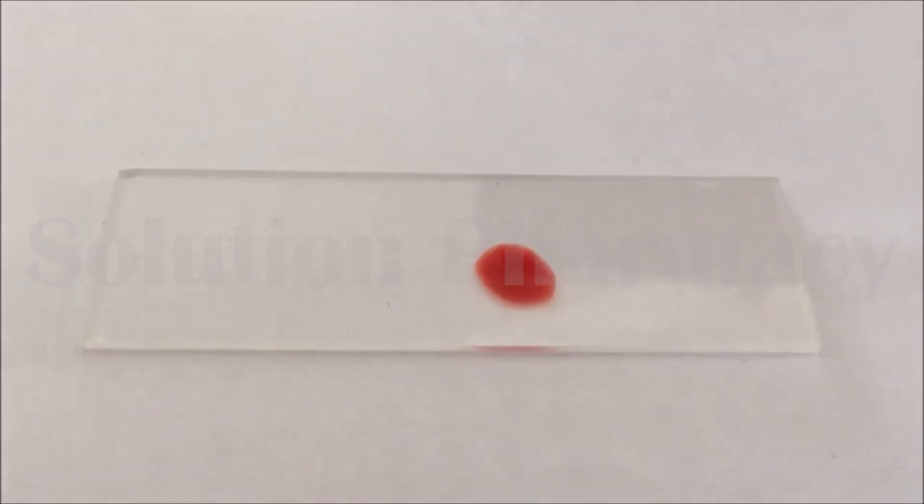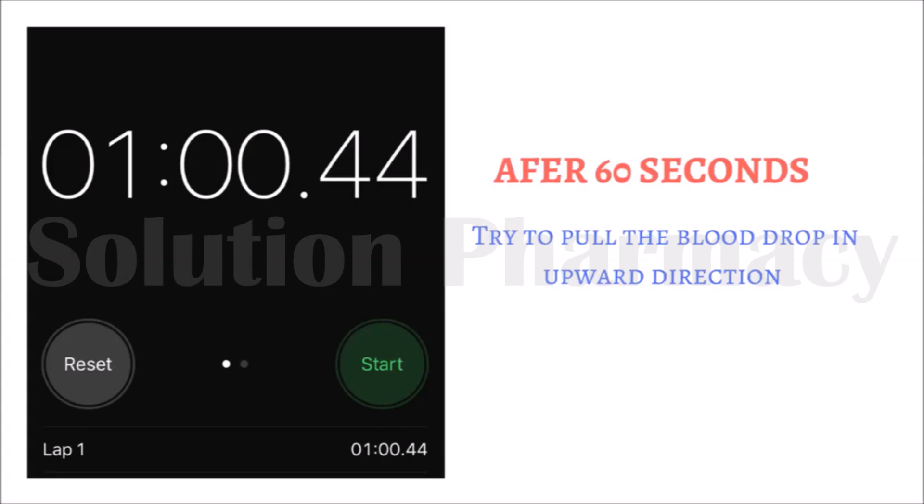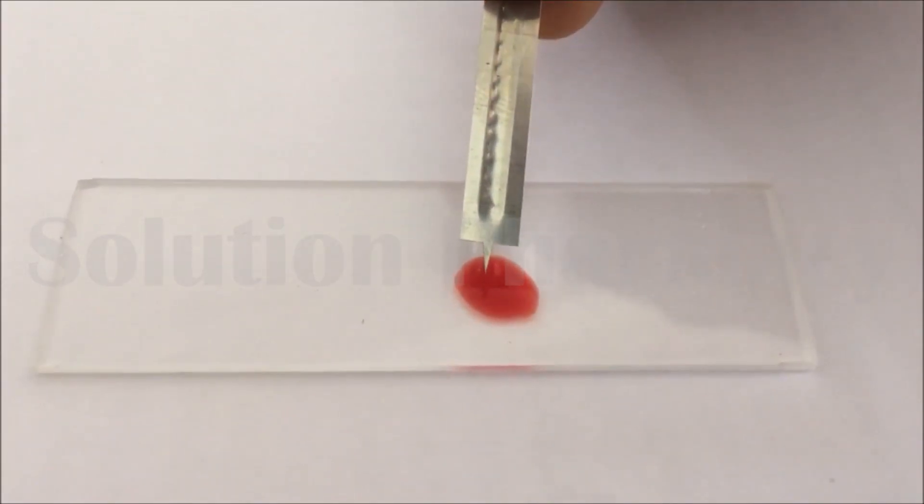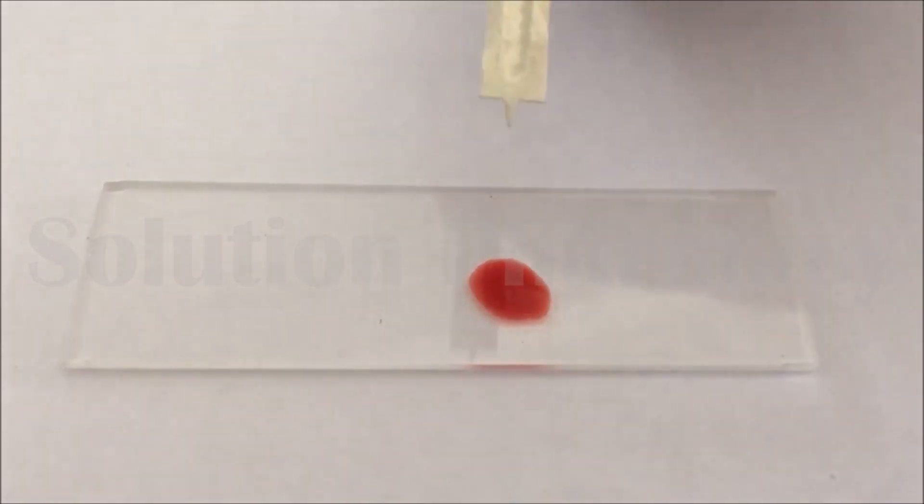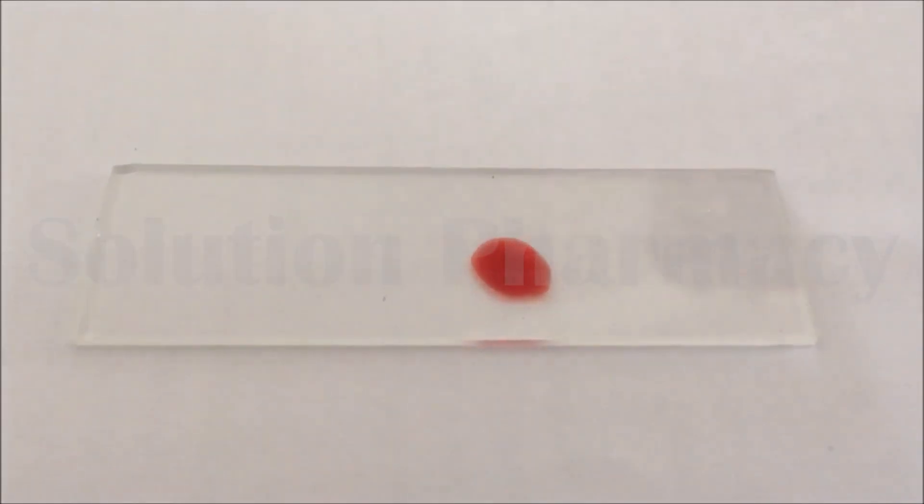Again after 60 seconds, repeat the same process. Pull the blood with the tip of lancet or syringe. After 60 seconds you can see there is no clot formation of the blood. Insoluble fibrin, which is thread-like structure, is not formed here.